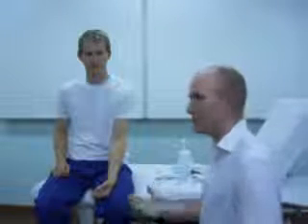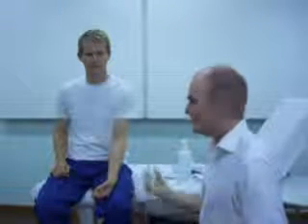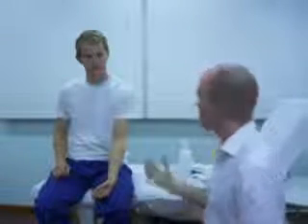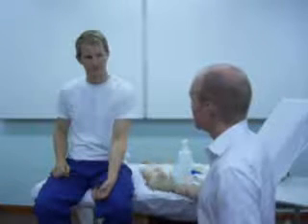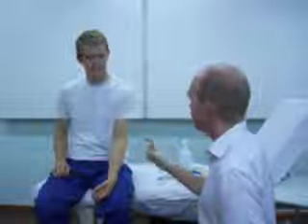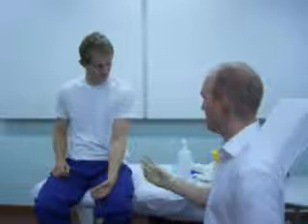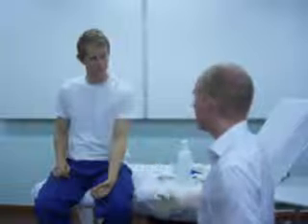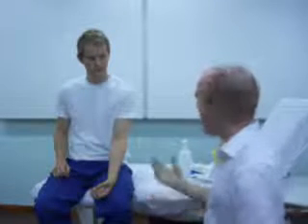Okay, for this video I'm going to show you an example of putting a cannula into a patient's arm in an exam type situation. So again, first introduce yourself and seek consent for the cannula, so you explain: you just need to put a small tube into the arm called a cannula. It's just a little drip that we pop into the arm that we can give medicines and fluids by.